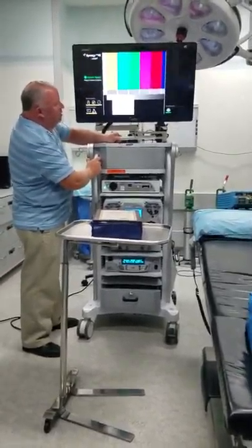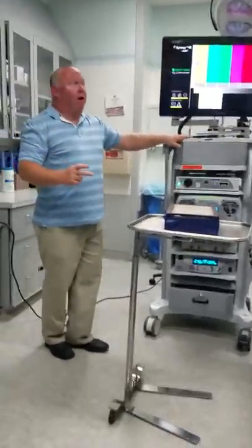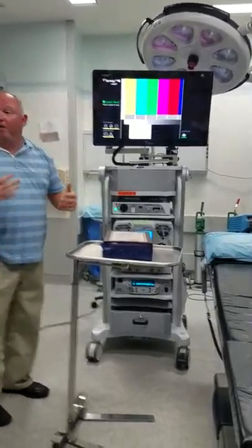But does it make a difference? It's a scope tower. A lot of places, if they do scopes only, you're actually just going to be in a big, we call it the boom. The boom is like one of these, but it's bigger. It's going to have two TVs. Why do they do that?